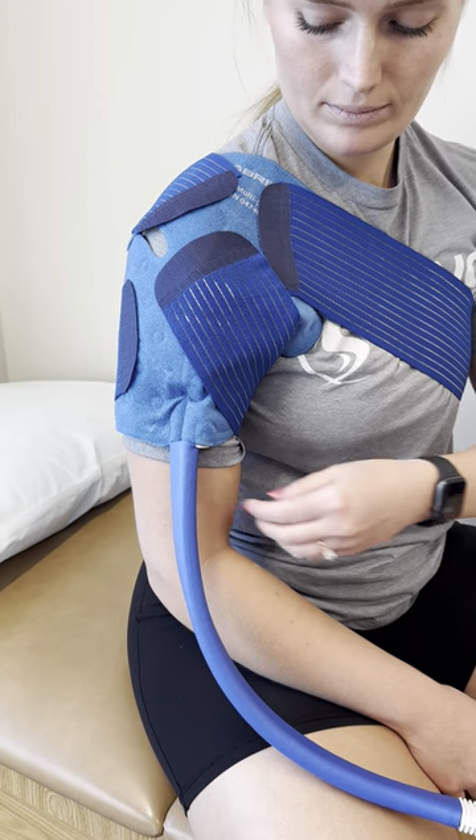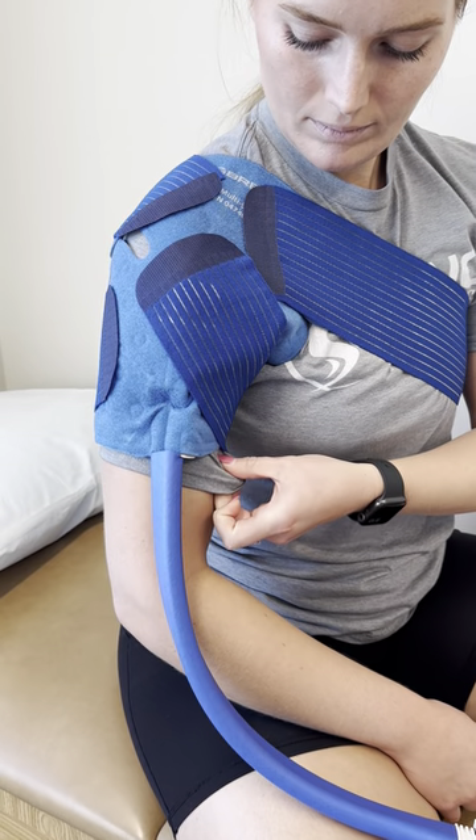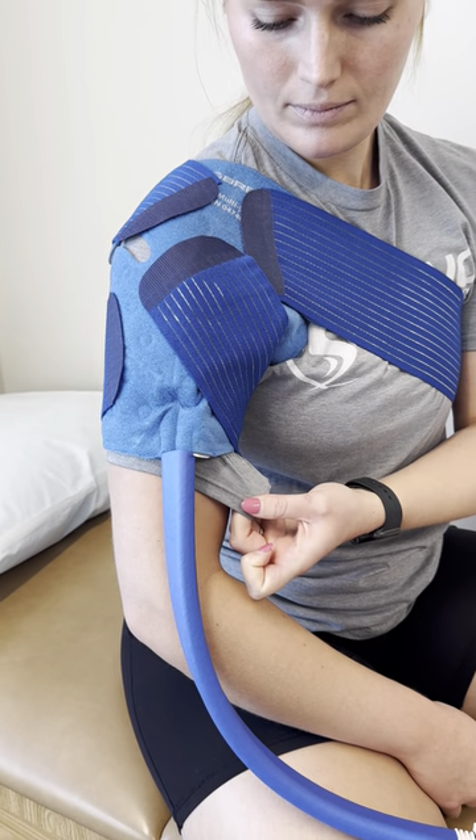Underneath the pad, you'll want to make sure you have a thin layer of fabric, such as a t-shirt or a towel.